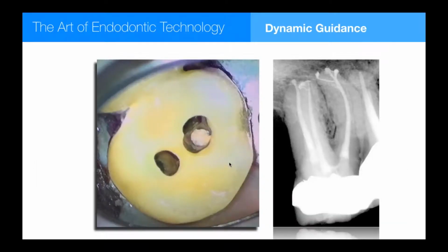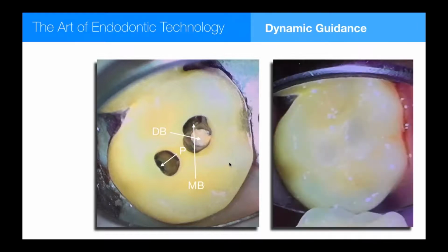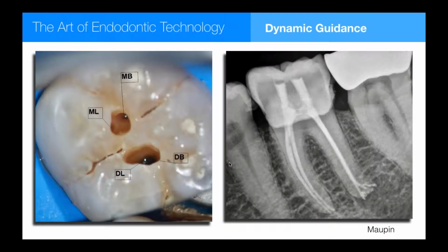And you can see we have only 2 openings, the mesobuccal and the distal buccal from this ovoid opening, and then the palatal through this separate opening. These smaller openings make it really easy to restore these ceramic restorations, leaving no evidence of a previous access. So I love this technology because it solved the worst problem I have. And here's one of my favorite cases of Charles.